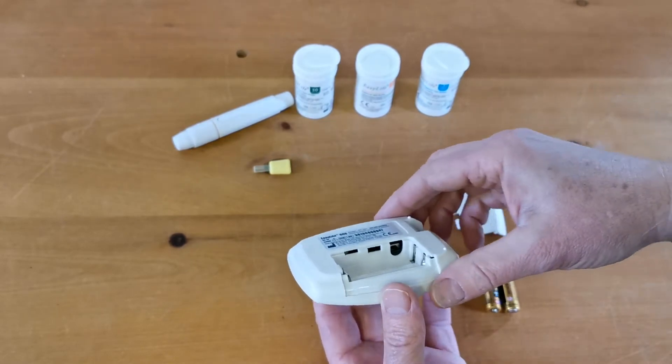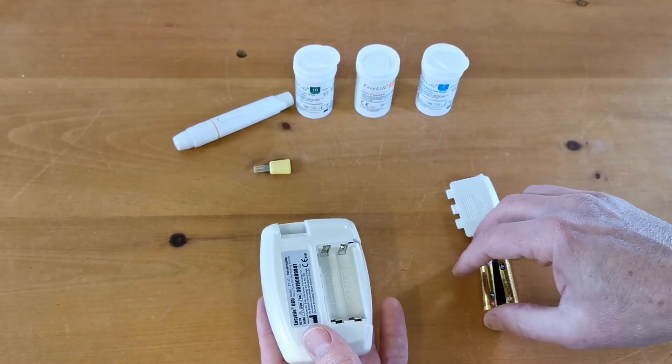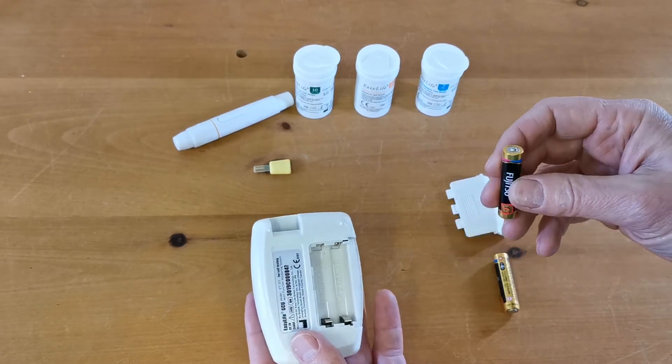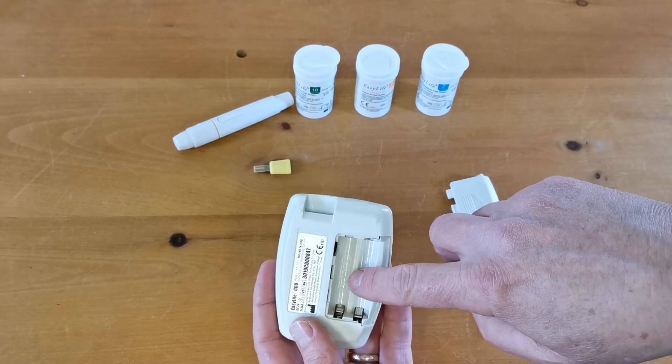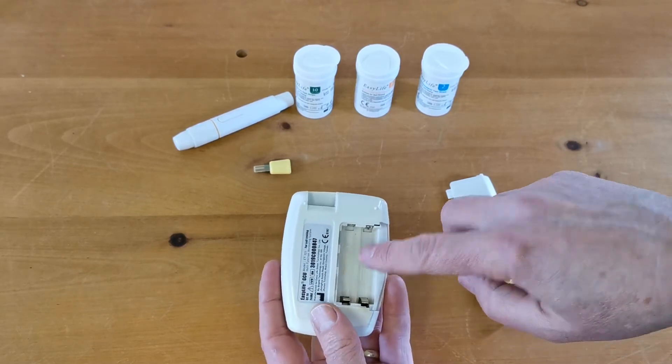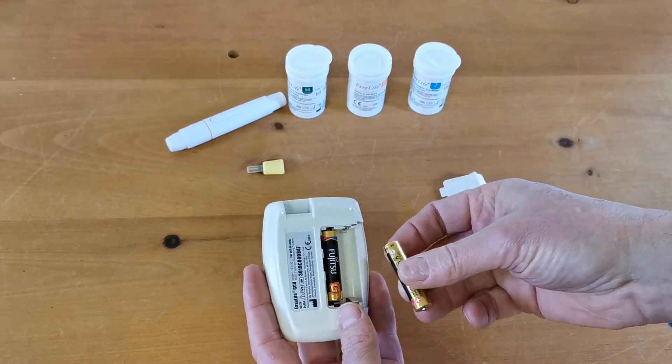So now we're ready to insert the batteries and start the date and time setup. Take the two AAA batteries that are supplied with the meter and follow the instructions for direction as shown in the base of the battery compartment. The first one goes in this way and the second one this way.